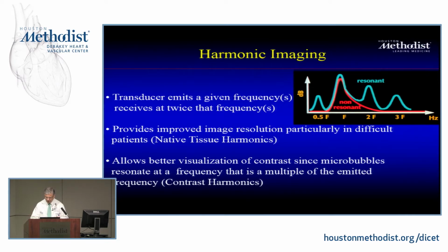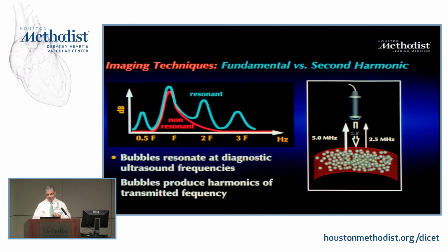So why are we talking about this? The interesting thing is it was developed for contrast. Obviously these tiny microbubbles reverberate a lot, compress and expand, compress and expand when you send the signal. So if I use harmonic, meaning I send my fundamental, and instead of listening on my fundamental frequency, I listen in second harmonic, then I'll have a stronger signal coming out from my bubbles as opposed to the tissue, and therefore I image wherever these bubbles are going, be it the cavity, be it the muscle, be it whatever it is.